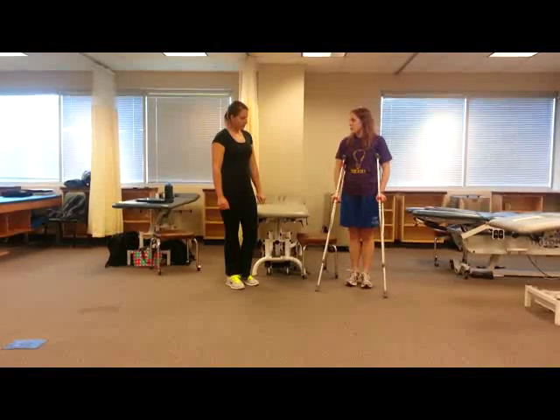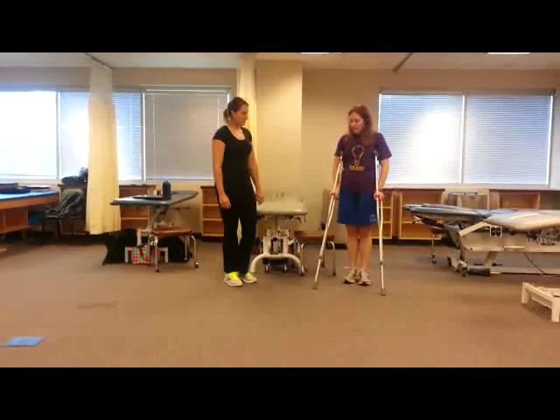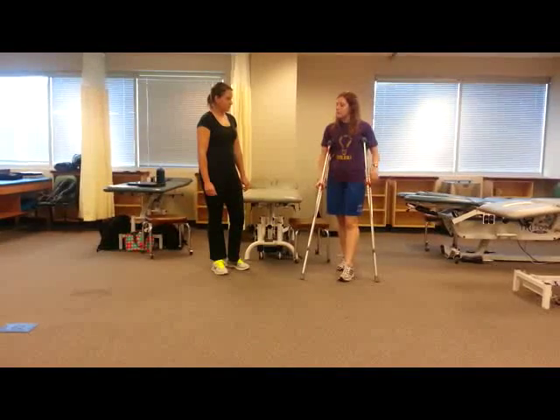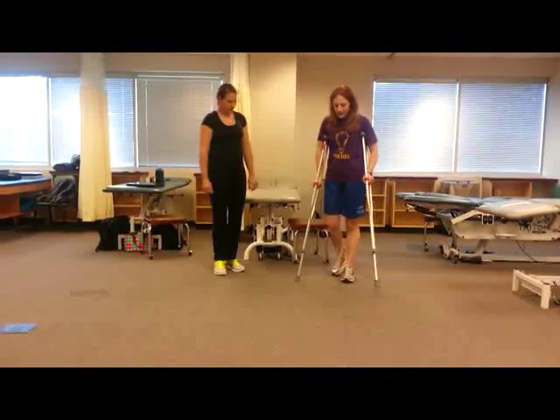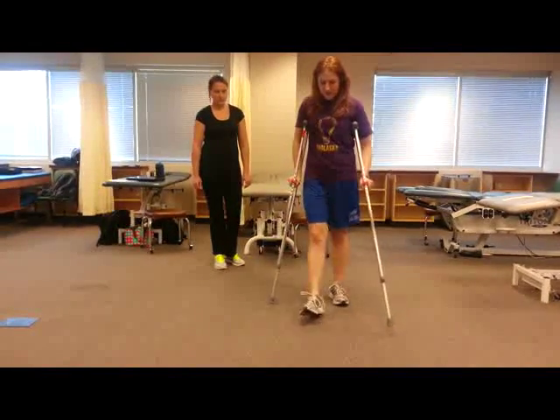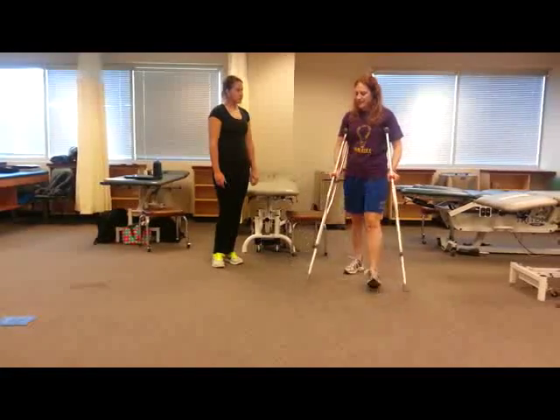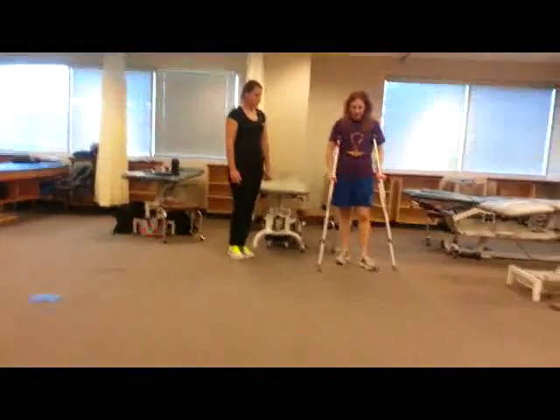The first one I'm going to show you is a two-point gait. This is a slightly faster gait — they're going to lift the crutch and their foot at the same time. It's always the opposite: whatever crutch you use, you lift the opposite leg with that. So it'll be crutch and leg together, then again together like that. We're keeping two points on the ground at all times — that's why they call it that.